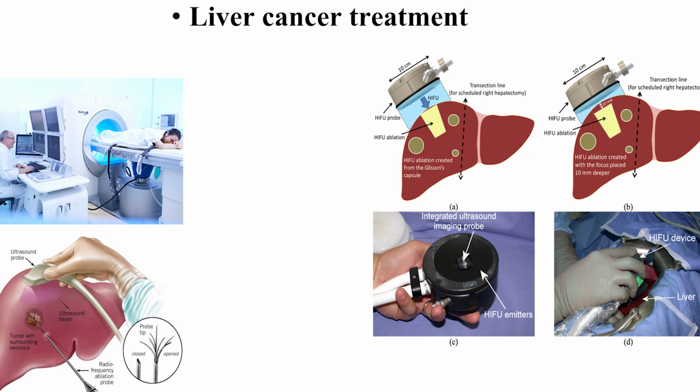And then here also you can see the device that is put onto the liver tissue with the HIFU device, and then by turning on the HIFU signals and ultrasound waves, the treatment will be completed.